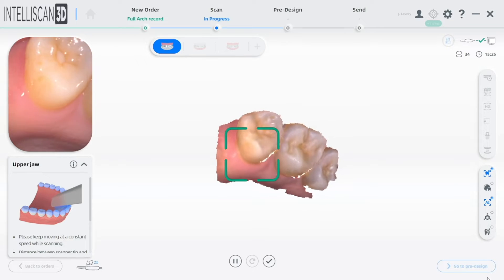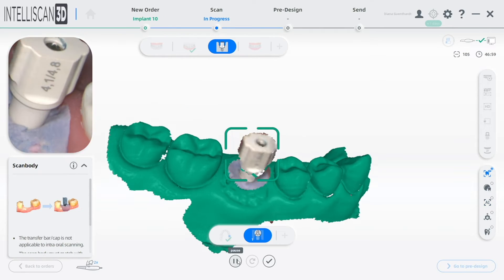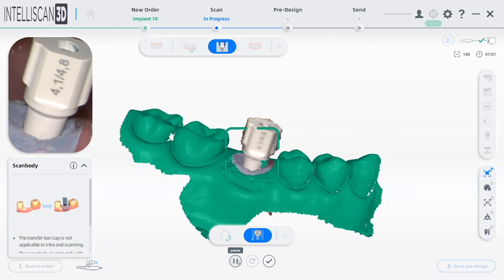The Intelliscan Model X not only has restorative, orthodontic, and implant workflow modes that are standard — Intelliscan Model X also comes with a treatment planning oral health check mode.